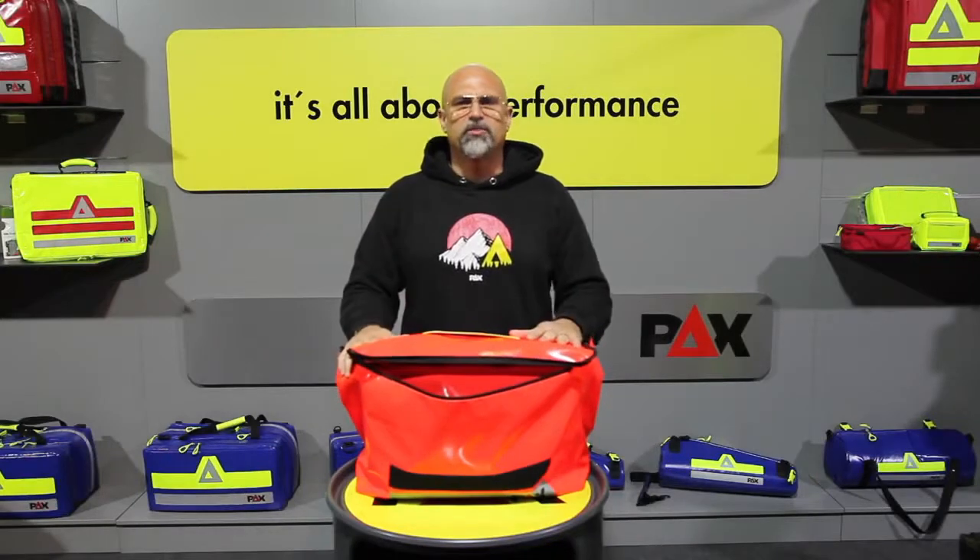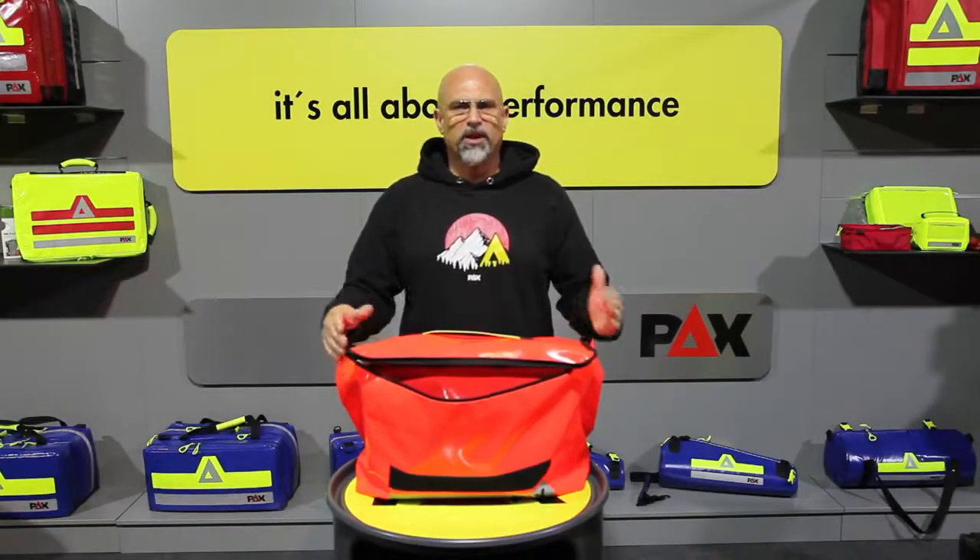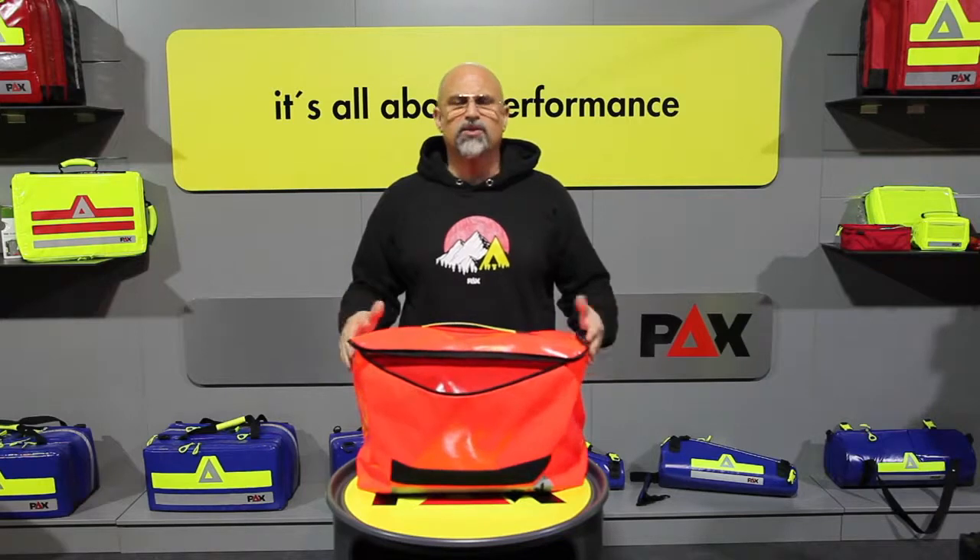All in all, a well-structured bag which convinces with a clear arrangement and easy access to its contents.